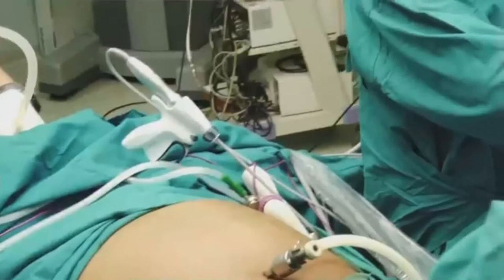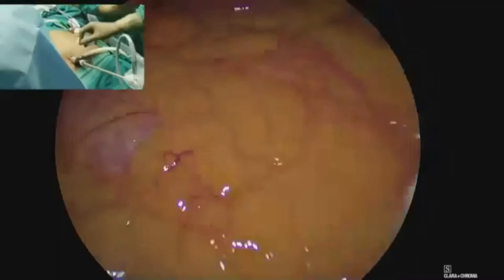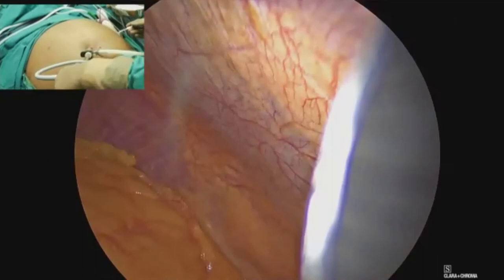The first step which we're going to do after we put in a scope is ask our anesthetist to again put a gastric calibration tube and remove all the fluid which is there inside the stomach. So he's going to put a tube. In the meantime, we put the ports. I don't see a lot of dilatation of the bowel. I think the bowel looks fine. I can perform any bowel associated procedure here. So if you can see, we have put an optical port.